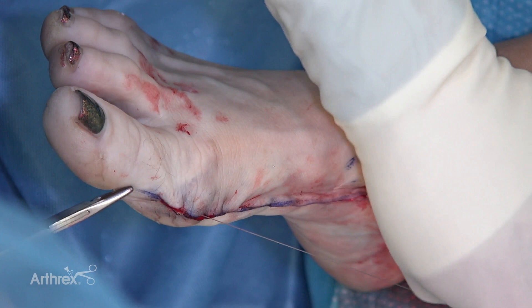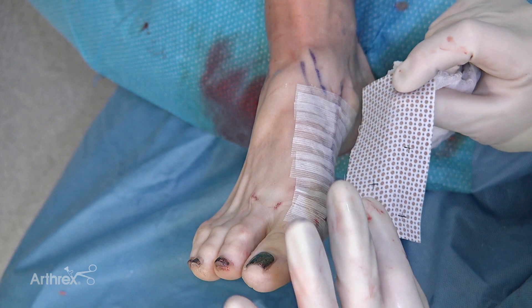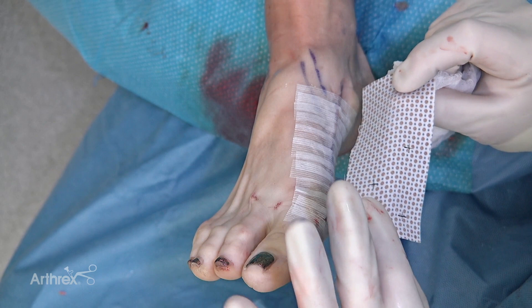So this is Jumpstart — this is silver-impregnated. It has cathodes and anodes to stimulate the incision of the skin. You can lay this over the top — it can go through the steri-strips. A moist gauze or hydrogel works — I put a couple of damp 4x4s over the top and then regular dressing.